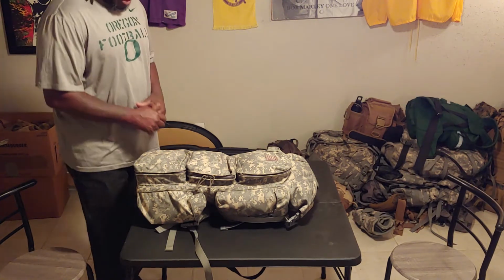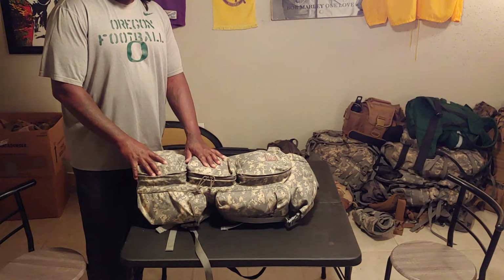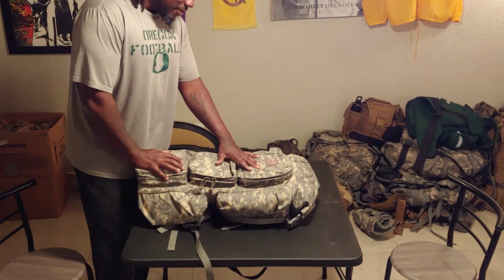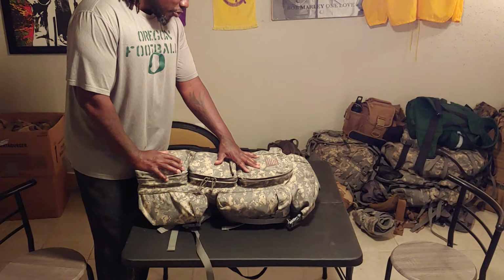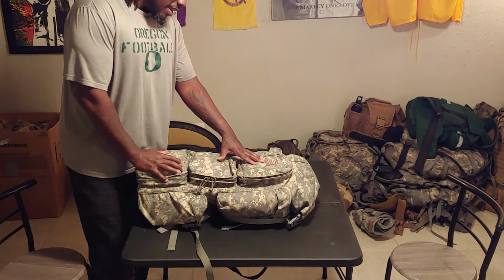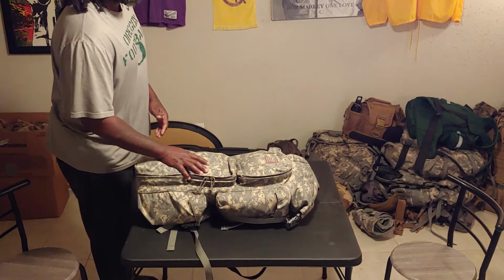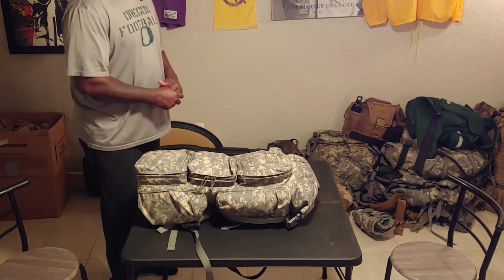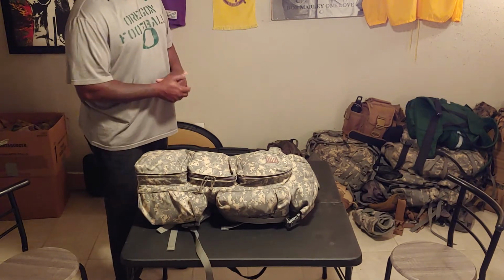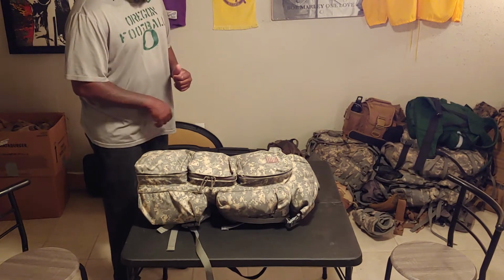So with that being said, I wanted to do a little video talking about this bag that I have here. Let me read it to you straight off of the tag. This is by North American Rescue Products. It's a combat casualty response kit, the warrior aid and litter. So basically, when the medical personnel is in the combat zone with the assault team, and please forgive me if I'm using these terms incorrectly, I don't know all the terms, but I'm just giving y'all the info.